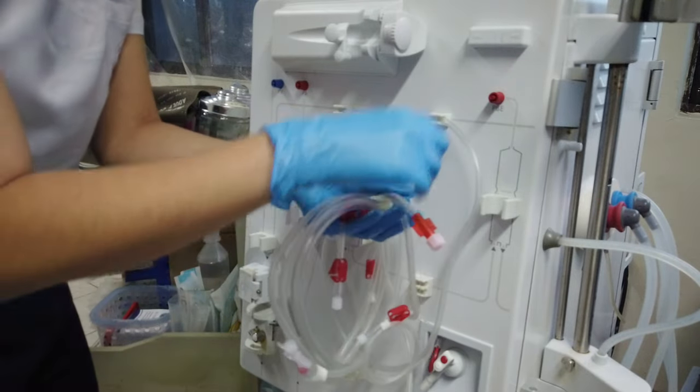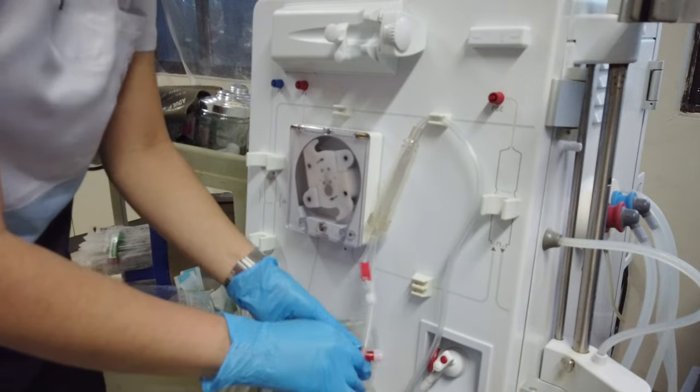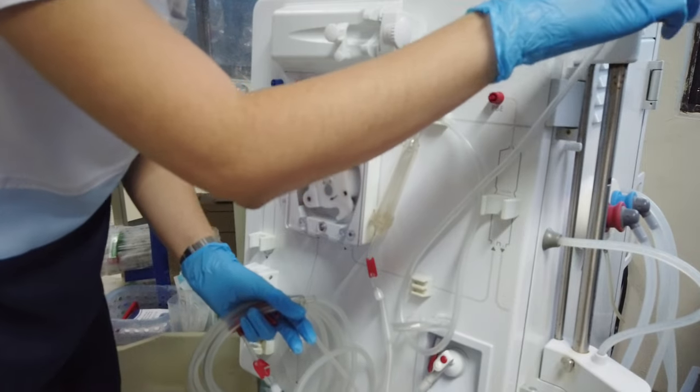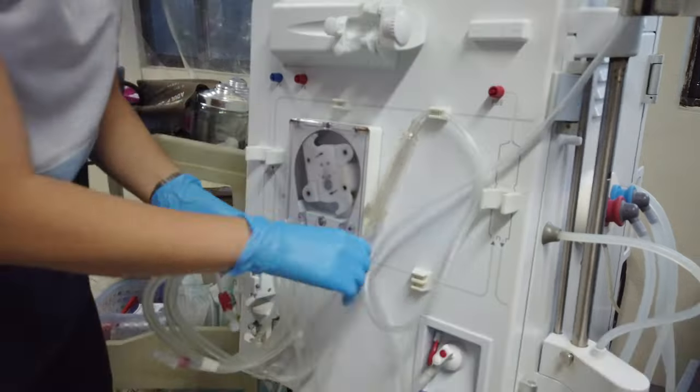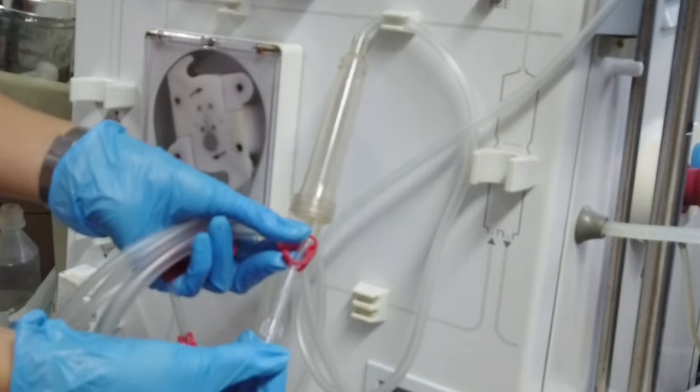Next, the dialyzer end. Remove the cord tie. Carefully untangle it and place it onto the dialyzer clamp or holder. Then close the small clamp nearby the chamber.